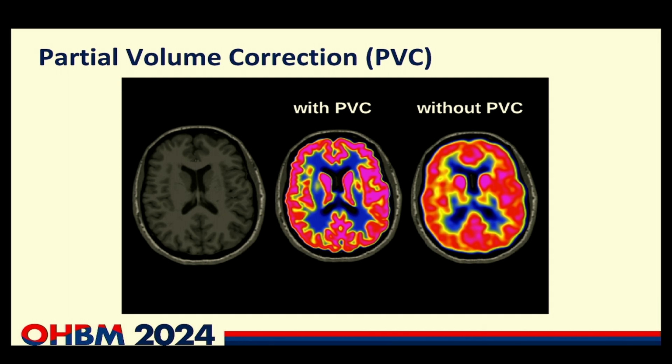So I think you will run into problems if you do this. And that's also why most people maybe stay a bit away from partial volume correction. But as Granville is mentioning, sometimes you have cortical atrophy, so you know there are differences, and then you need to try to take it into account. Okay, thank you for the questions.